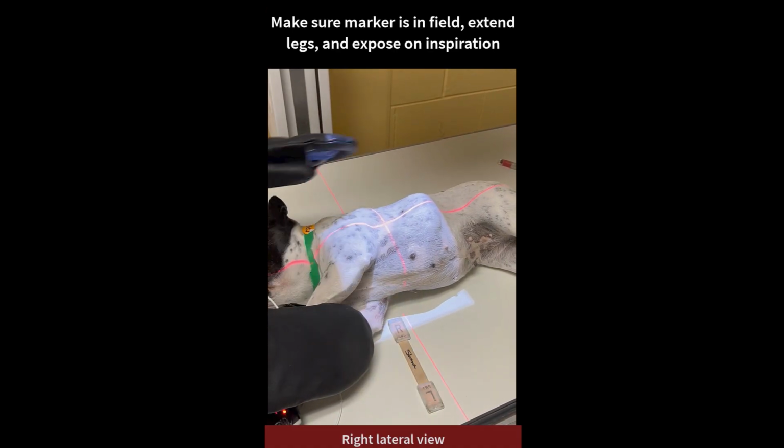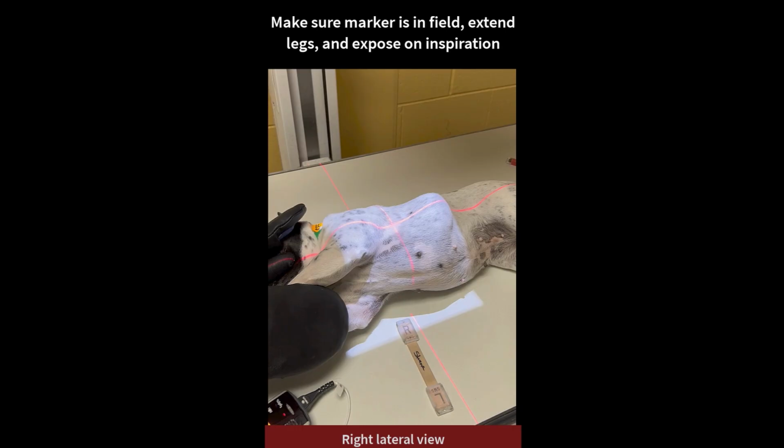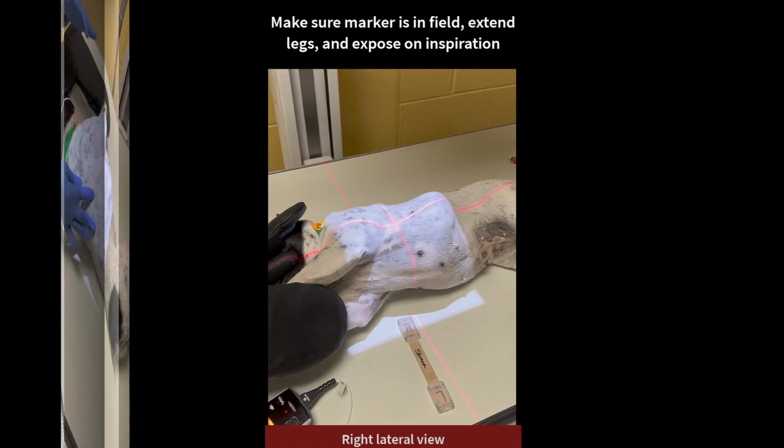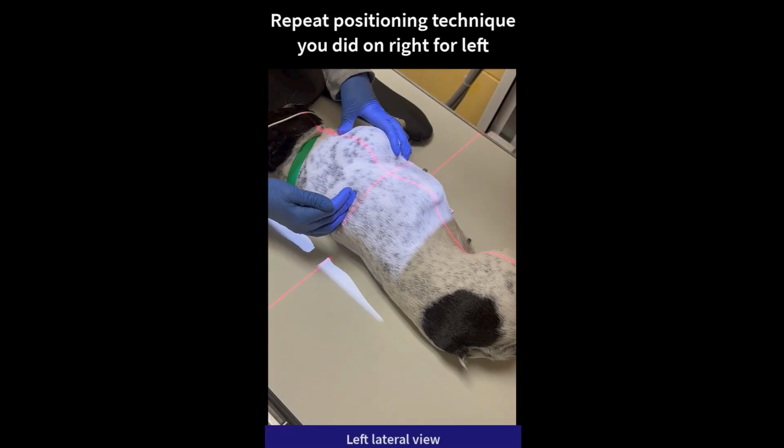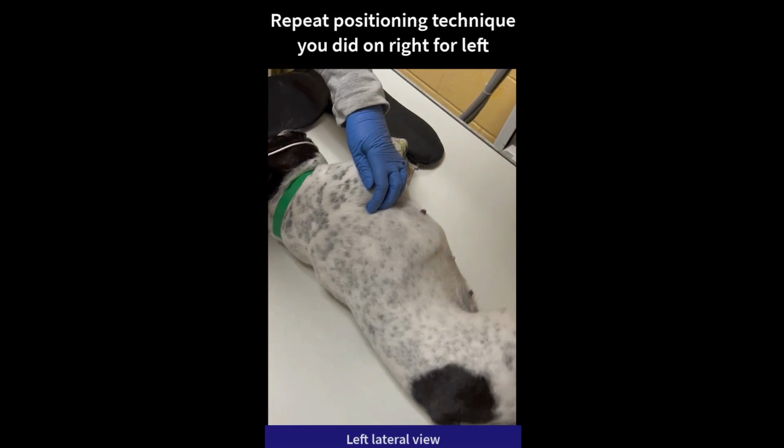Make sure that the correct marker, right marker, is in the field of view and is not superimposed over the relevant anatomy. Extend the thoracic limbs cranially and acquire the radiograph during the inspiratory phase. Repeat positioning techniques performed for the right lateral in a left lateral recumbency. The same radiographic technique exposure setting may be used.